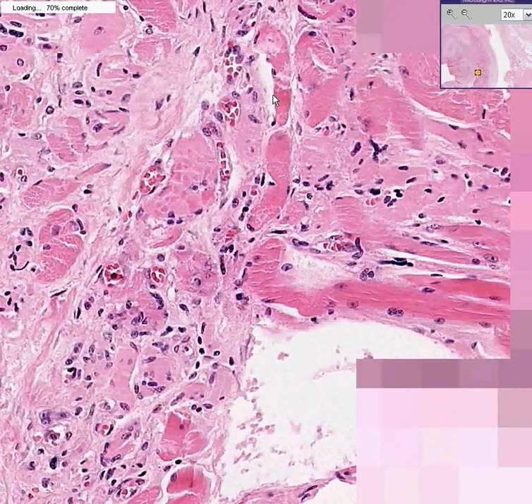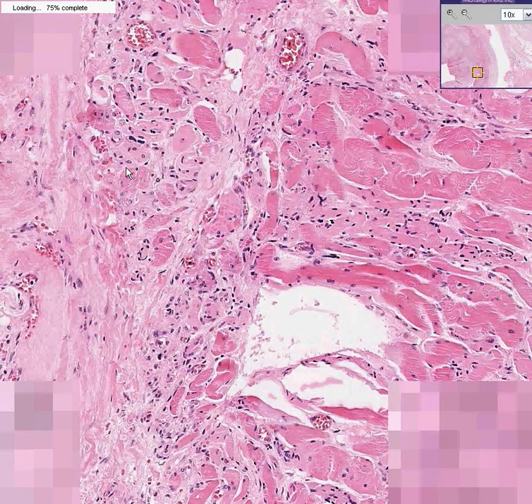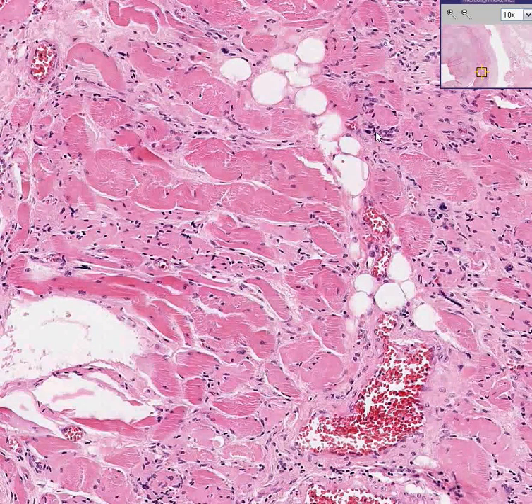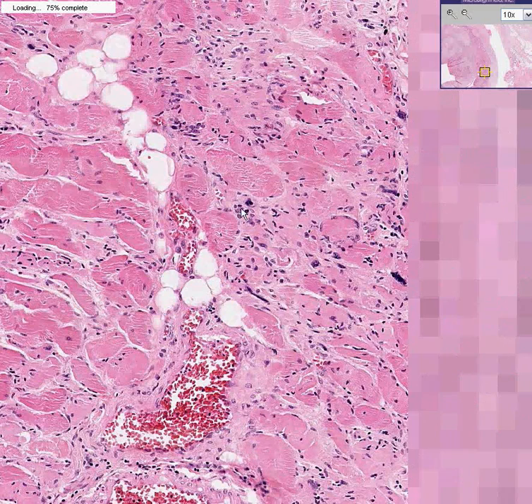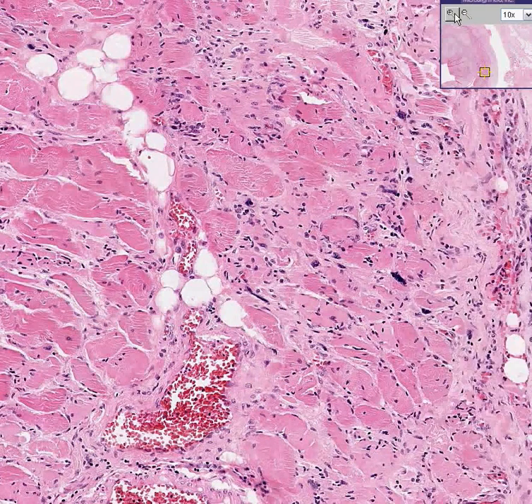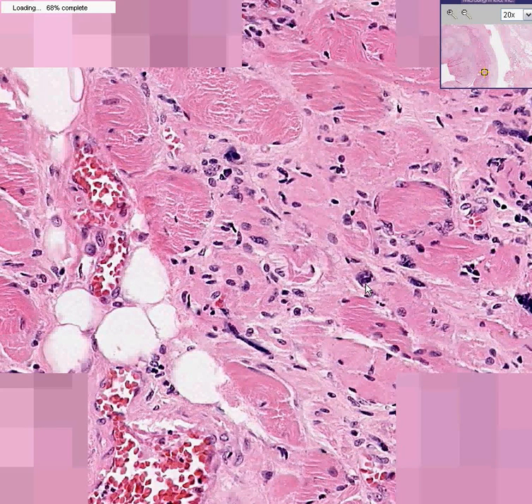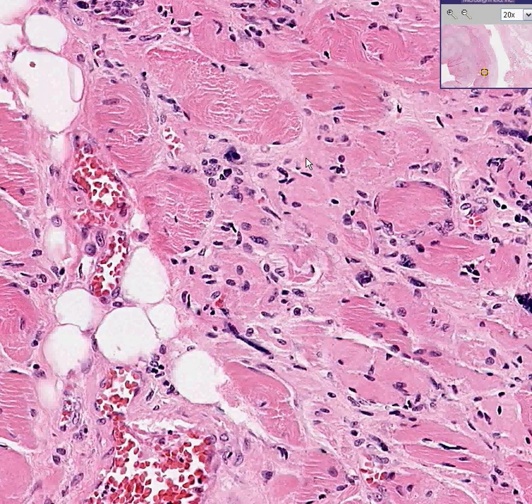Here's some tumor cells here, here, and here. If we zoom in on these, you can get a better idea that they really are malignant-looking cells. Look at the nucleolus on that cell. Look at the hyperchromasia of that cell or perhaps small group of cells. This is a classical appearance of a linitis plastica — poorly differentiated adenocarcinoma infiltrating, often as individual or signet ring cells, diffusely throughout the full thickness of the stomach wall, making it look like a leather bottle.